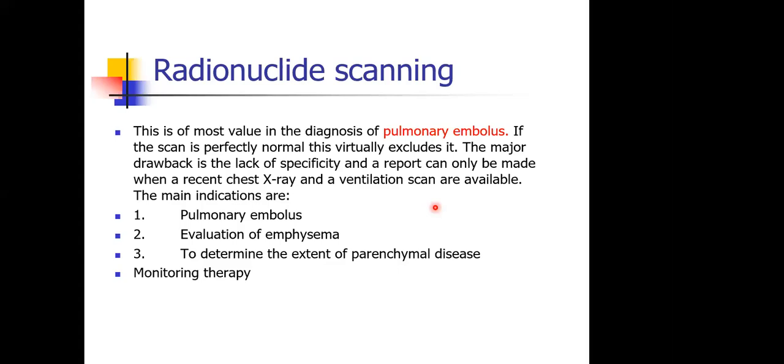In addition to pulmonary embolus, it's also used to evaluate emphysema and also the extent of other parenchymal lung diseases.